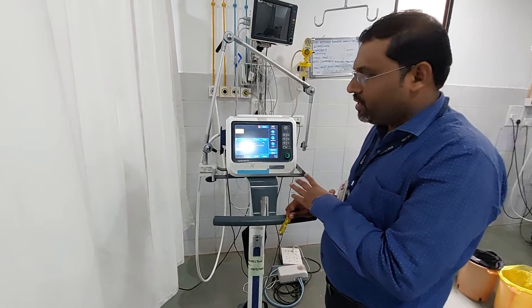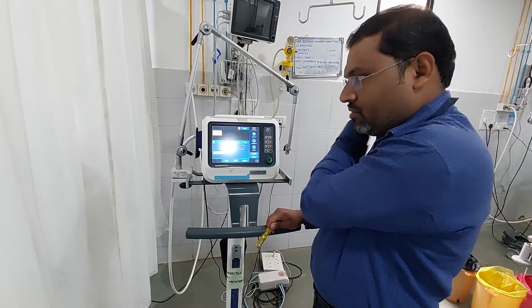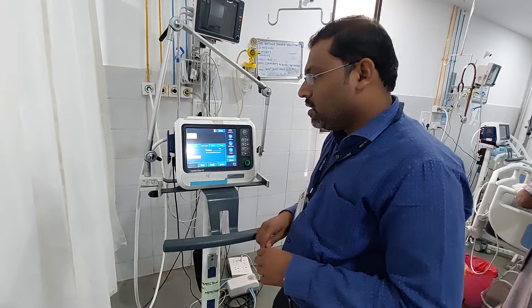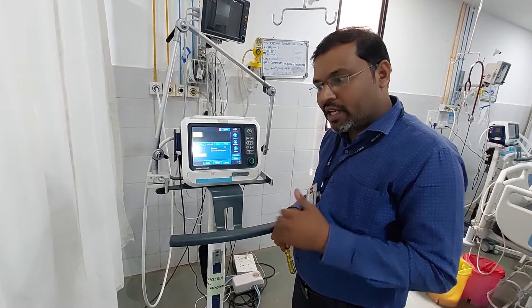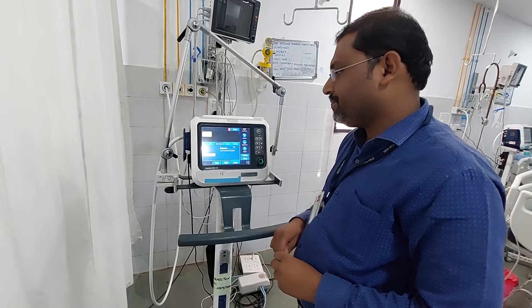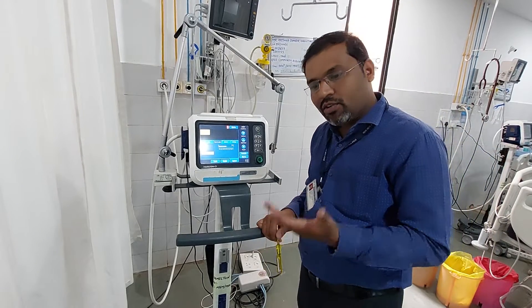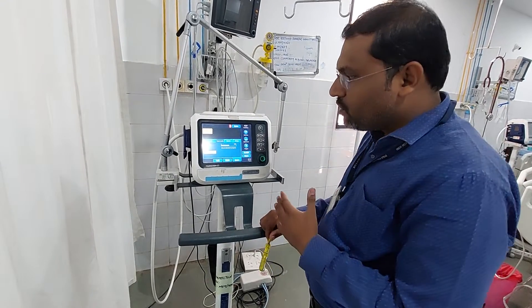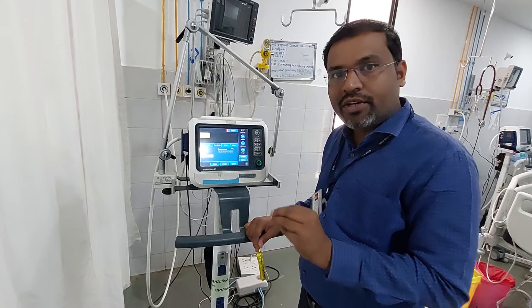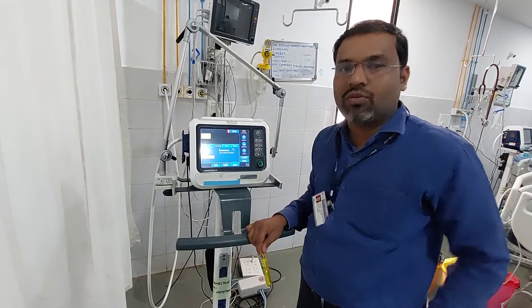Once calibration is performed successfully — because your O2 cell is working properly — it will give you a tick mark. It will show you the date and time. The use of the O2 cell is to monitor whether FiO2 is being delivered to the patient. It is only a measuring component. If the O2 cell is defective it will not give you a FiO2 reading, but the machine will still deliver oxygen — it just will not display it. So the O2 cell's role is to measure and display the FiO2.